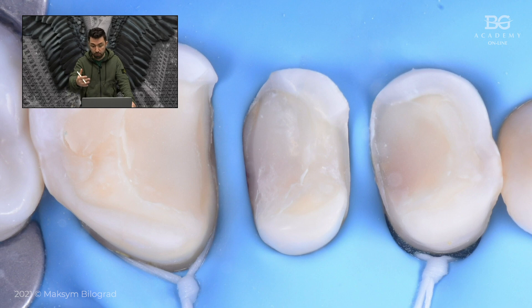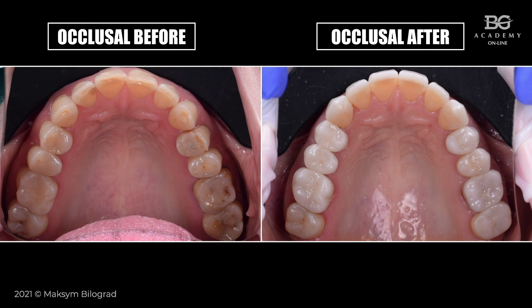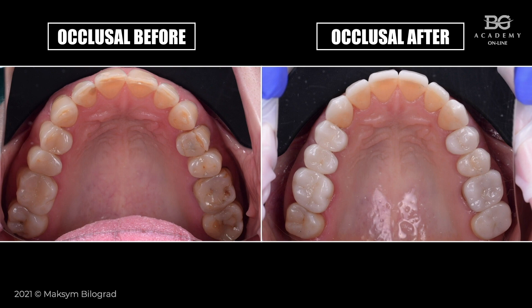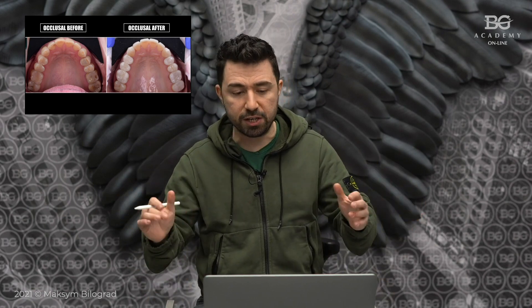This is the process of cementation that was done at the next appointment. We performed rubber dam isolation, and here you can see the before and after of the big rehabilitation. As I mentioned, this is a full mouth rehab case — a big case with many procedures and different manipulations. The endodontic treatment was just a small part of the big picture.